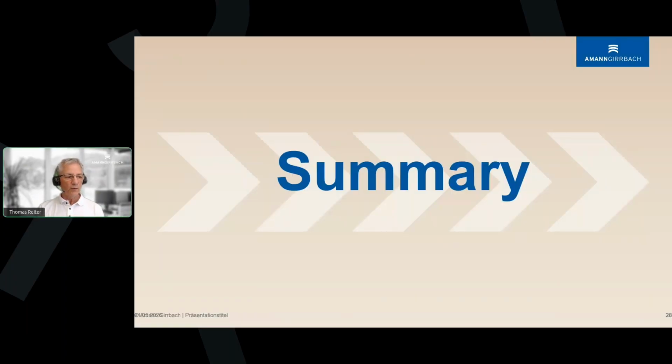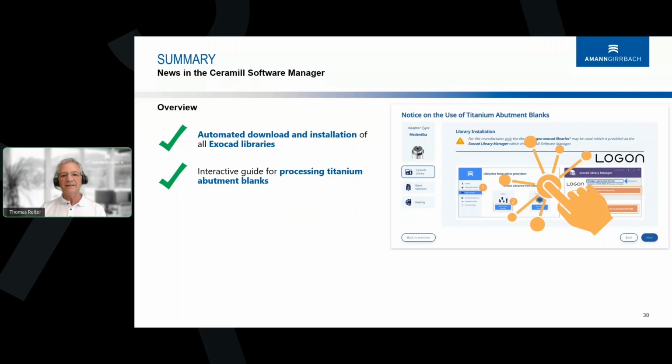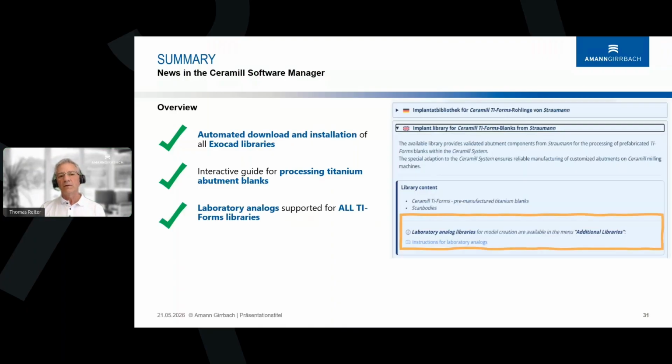Coming to the summary, we are right on time. Have we achieved our goal? I really think so. We automated the download and installation of all Exocad libraries. We created an interactive guide to make the processing of titanium abutments really clear. We supported the way to get lab analogs for all TI forms.